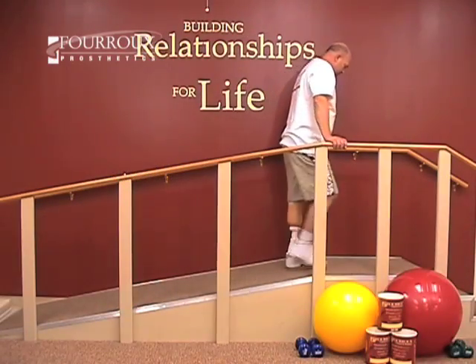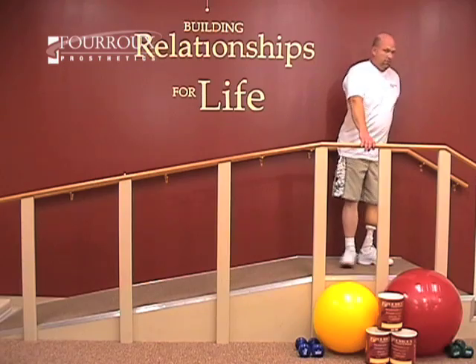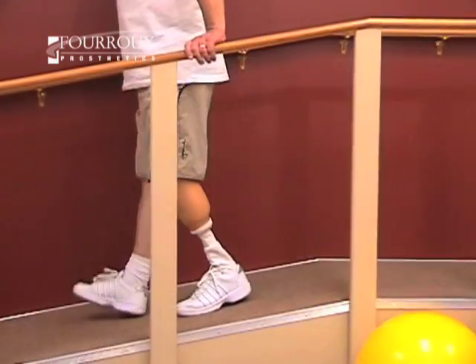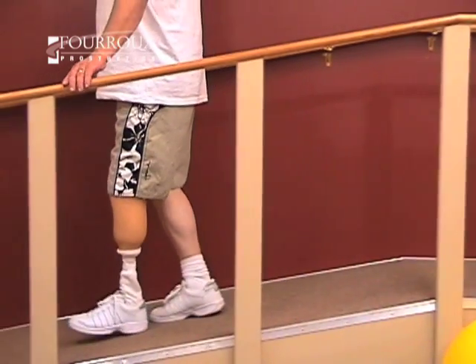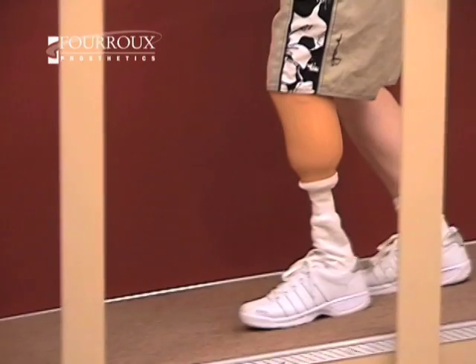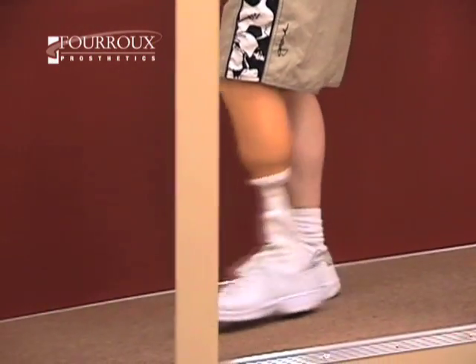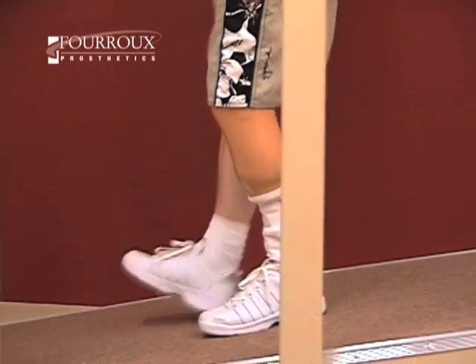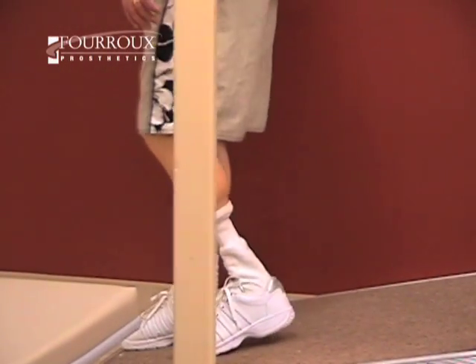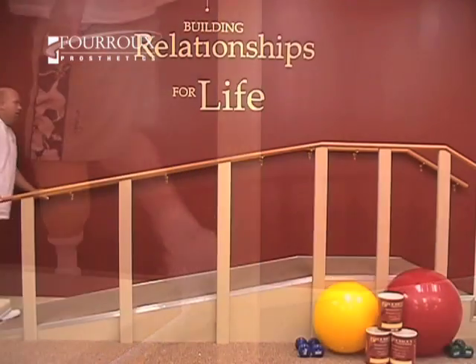In this demonstration, you'll learn the proper way to walk up and down an incline. Start by walking down an incline. Control your residual limb while swinging your sound side to take a step. Avoid quick motions. Instead, focus on keeping movement smooth and even. Allow your quads and hamstrings to strengthen during this exercise.